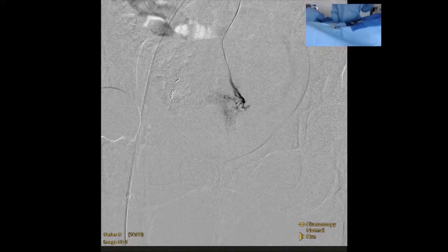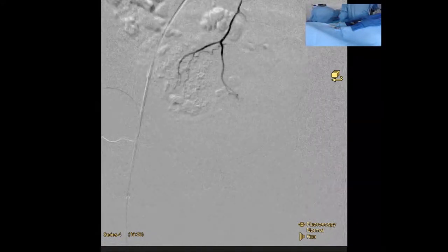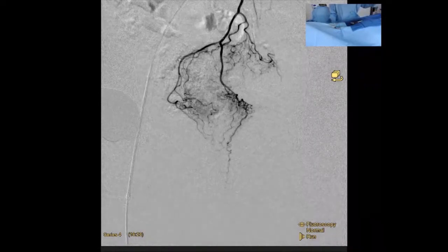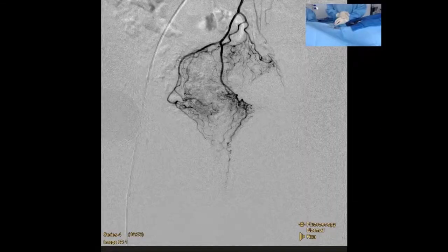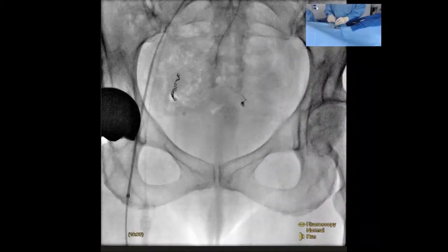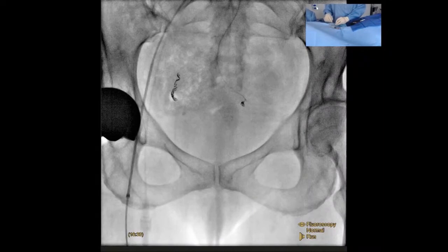So following this, let's go back and review our previous set of imaging here. We were right at the bifurcation. When we're looking at this, it looks like we've gotten the dominant two vessels that are supplying us. Are there some other small branches? This comes up all the time: should you try and chase down these other tiny branches that are more in the central portion of the rectum, if you will, not on the lateral walls? If they were larger than this, or there was flow down to the cushion, absolutely. But in someone like her, it's not. You're more likely to cause harm and perforations going after those things than you are otherwise. In some other cases where the arteries are much larger, absolutely.